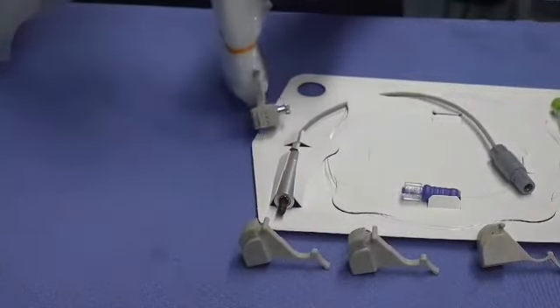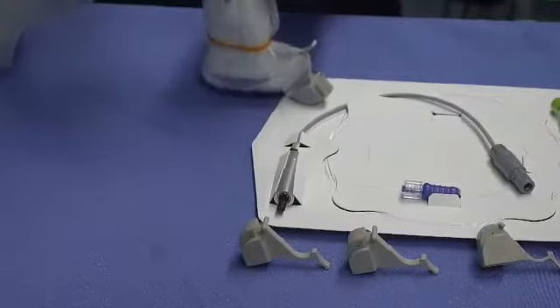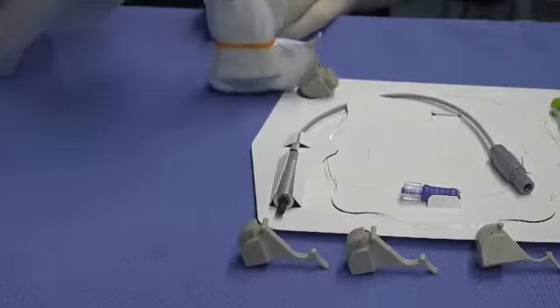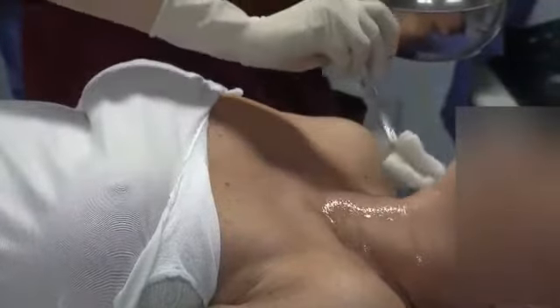Each guide has 5 accesses for the guide needle. The first access is the most superficial. Gradually, the 5th access is the deepest one. The sterile field is prepared with an antimicrobial solution.